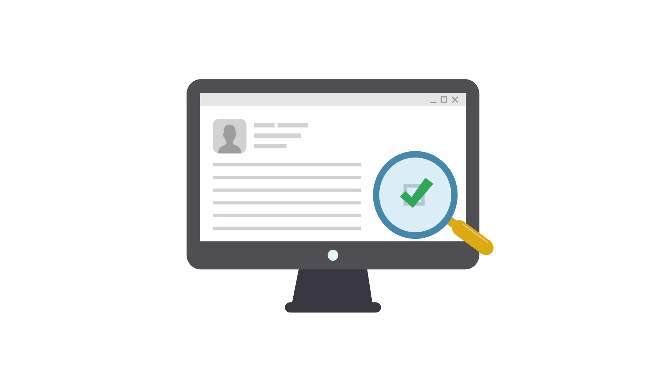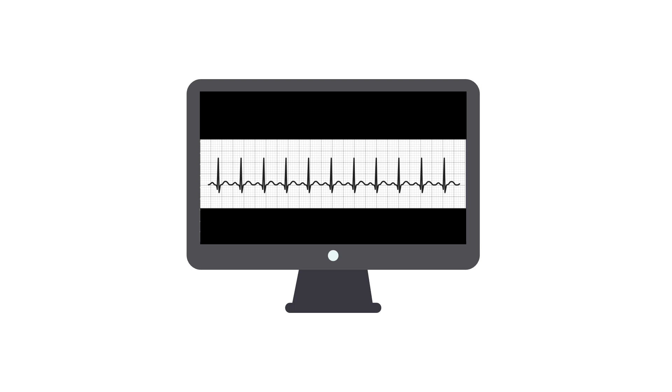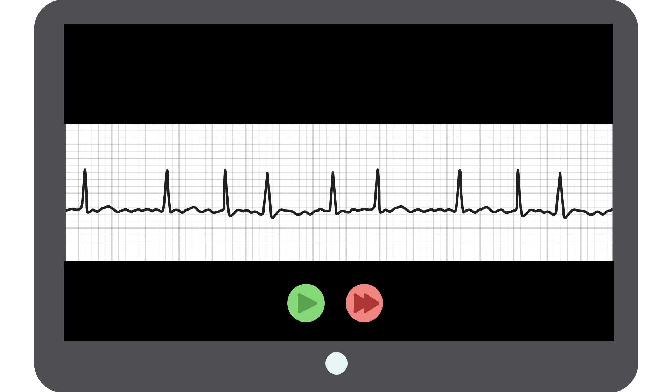When it comes to downloading and analysing the ECG, it is best to take a structured step-by-step approach. A lot of the modern Holter analysis systems will auto-analyse the recording as it is downloaded. They also have a variety of functions to help you review the recording, such as stop, start and pause functions, which allow you to play back selected portions of the ECG. You can also zoom in and zoom out on selected ECG strips and choose to run the strip at different speeds.